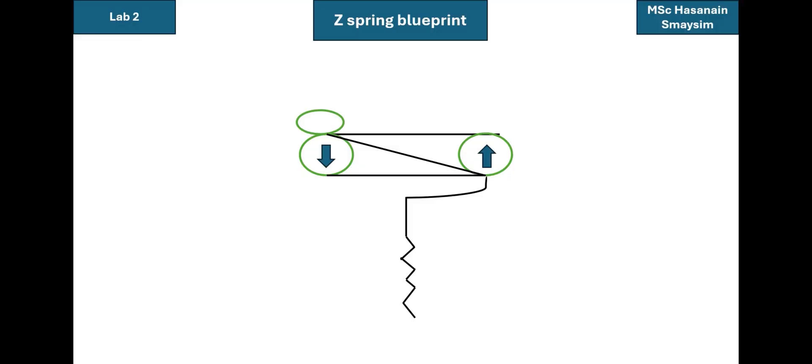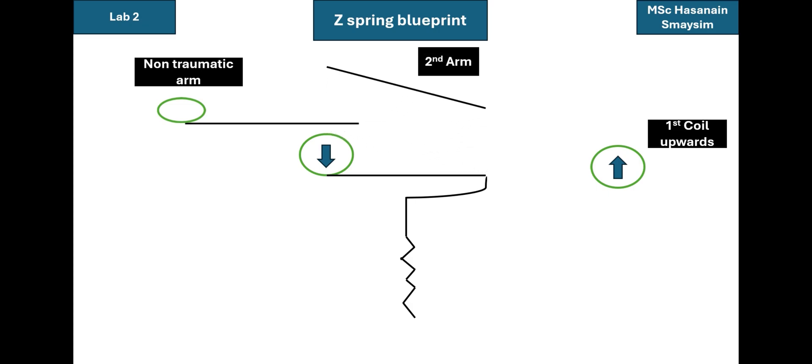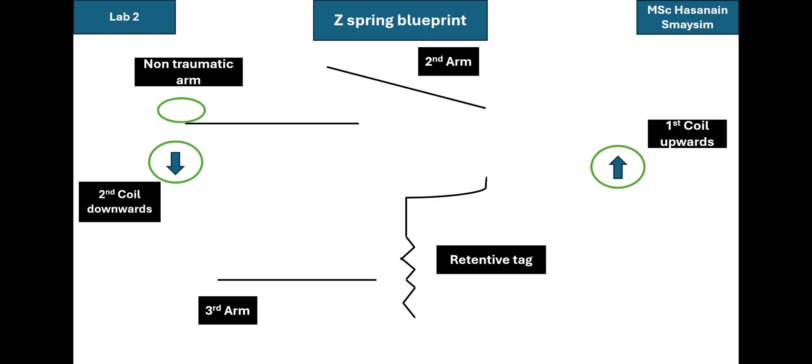This is our Z Spring. Let's highlight its parts. First, we have the non-traumatic arm or the active arm, which is the site of force application. Next, we have our first coil, which should be opposite to the second coil — in this demonstration I'll assume it's bent in the upward direction. Next, we have our second arm, then our second coil, which should again be opposite to the first coil and thus should be downward, then our third arm, and finally the U-loop and the retentive tag.